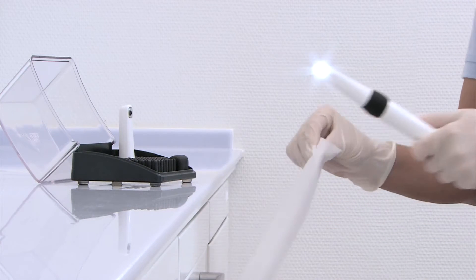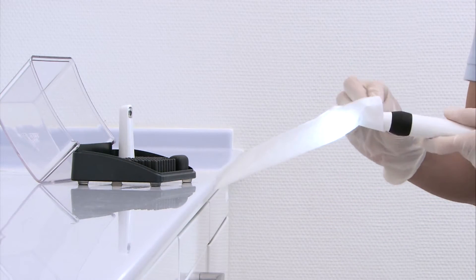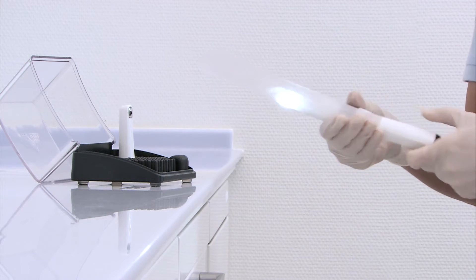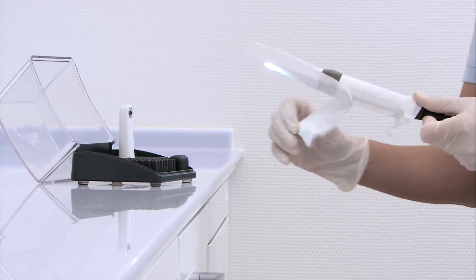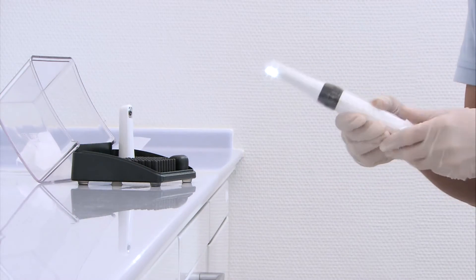Disposable protective sleeves have proven their worth as a sensible way of preventing infection. Alternatively, a quick disinfection method can be used, for instance FD350 disinfectant wipes by Dürr Dental.